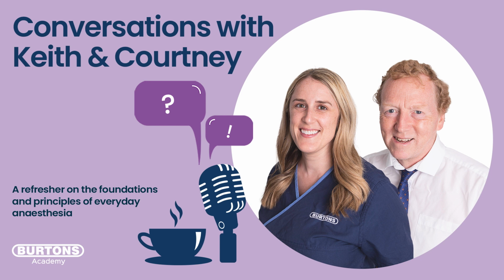So I did say earlier on that part of this process is we ventilate, we look at the capnograph, and we look at the end tidal CO2. Again, another huge subject in itself, but let's just focus on that end tidal CO2 value. We'll assume that everything's set up nicely. We're not rebreathing, our inspiratory CO2 is normal, and we've got a lovely capnogram trace. Our end tidal CO2 would hopefully be between 35 and 45 millimeters of mercury, so on that basis, our target is 40 millimeters of mercury end tidal CO2.